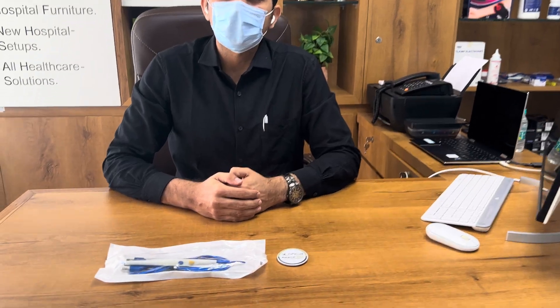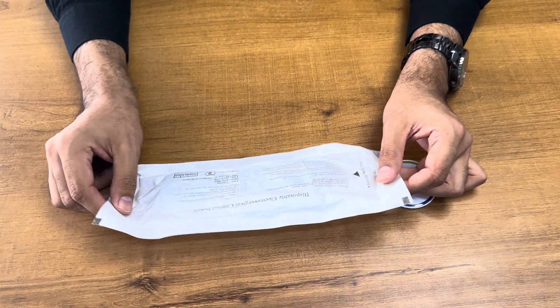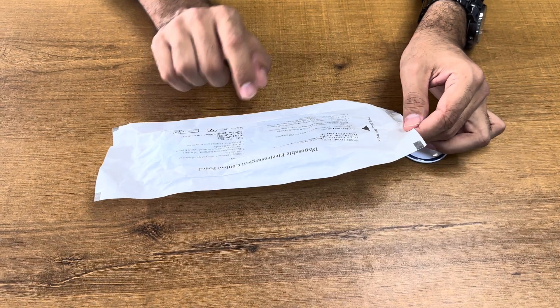Hello friends, welcome to Otika Meditronics Company. Today we are going to demonstrate an unboxing and usage of a disposable cautery pencil, or we can say electrosurgical control pencil.